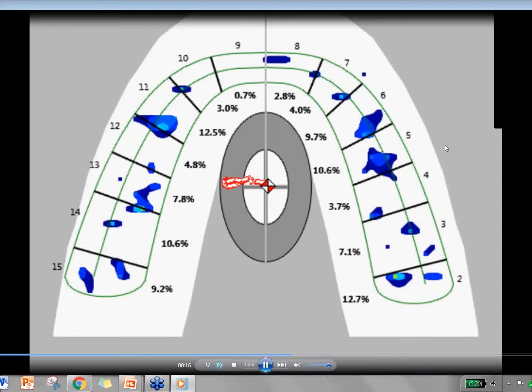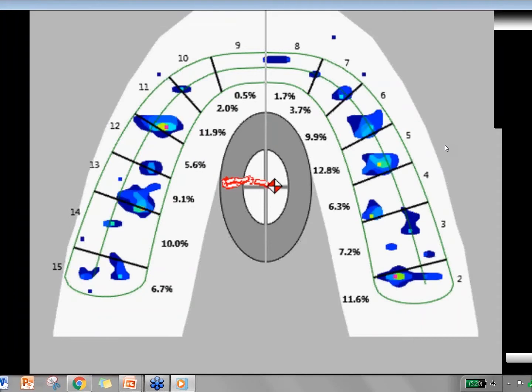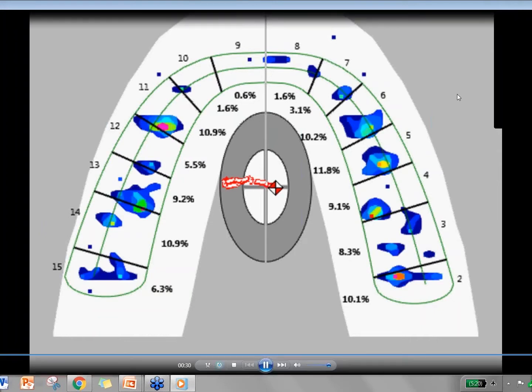It's off a little bit on the left. It immediately comes over. This all happens in milliseconds for us, and that's a really nice finish. We end up with her bite right in the middle there. It's fairly even. She's just about 50-50, which is, again, what we're looking for.